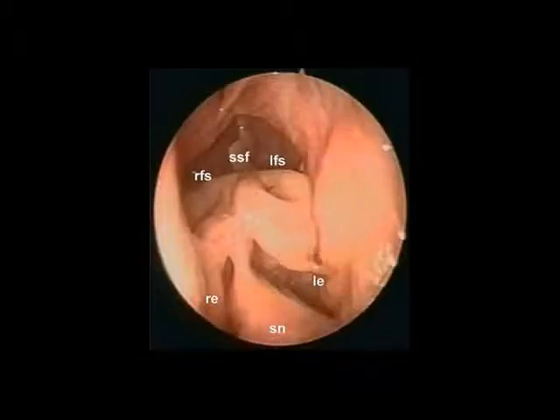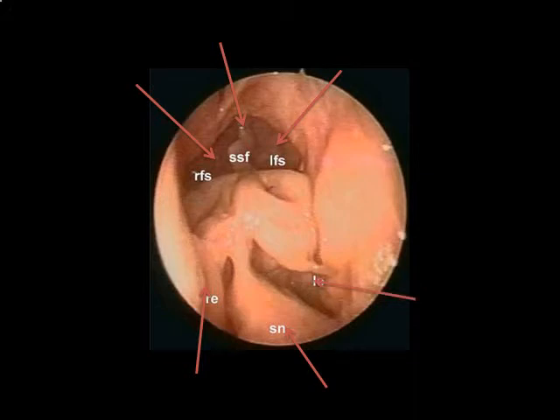This is the median drainage procedure done 1 year postoperatively. That is the right frontal sinus, the left frontal sinus, the intersinus septum, the nasal septum, the right ethmoid, and the left ethmoid. The median drainage procedure, or the Draf 3, 1 year post-op.